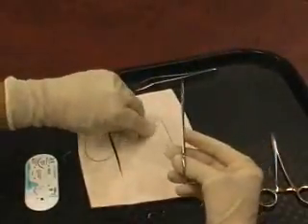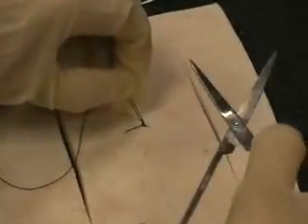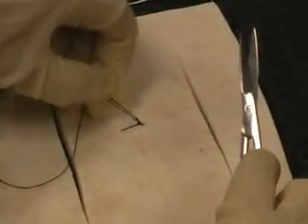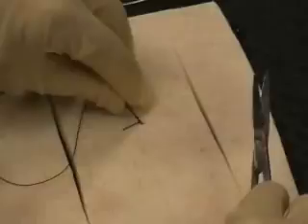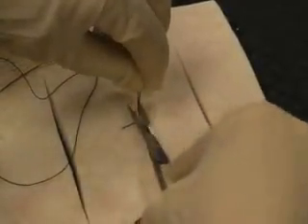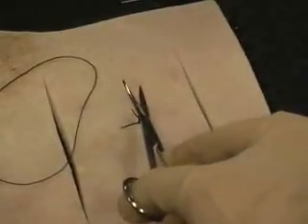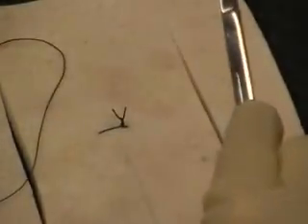We're in the tripod grip. You're going to actually open the scissor tips, but not excessively. Only open as far as what you need to cut. You can put the two ends together. You're going to actually slide down, turn 45 degrees, and cut. Basically the steps are, if you were holding longer suture, you would actually go all the way down 45 degrees either that way or that way and cut. And that's the way that the scissors cut best.